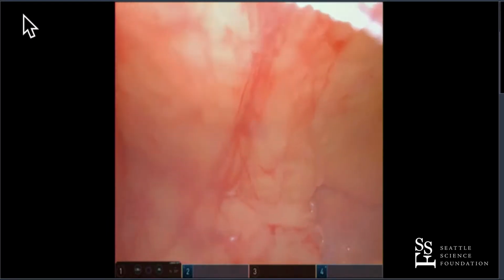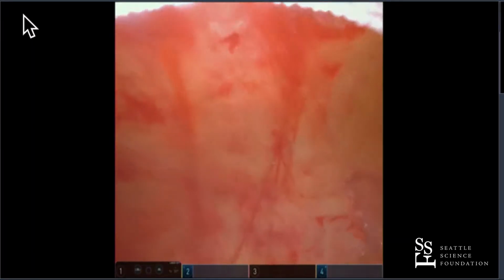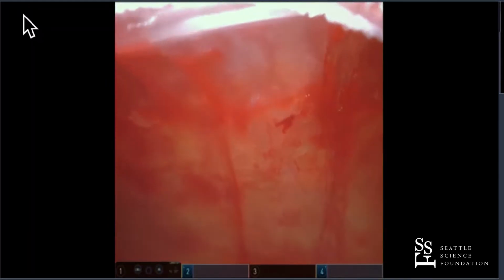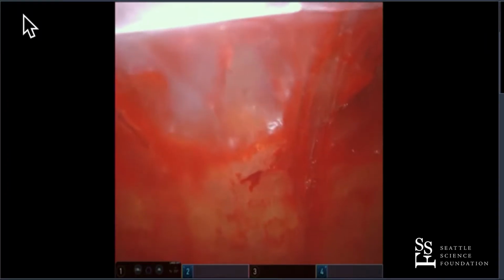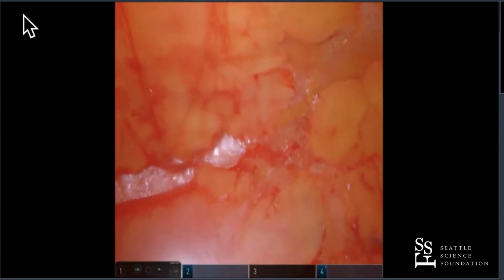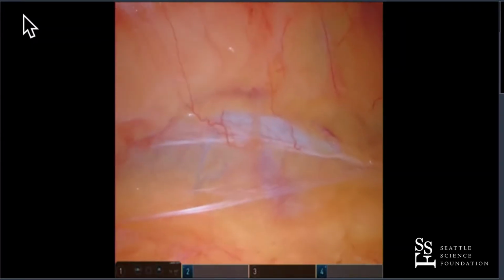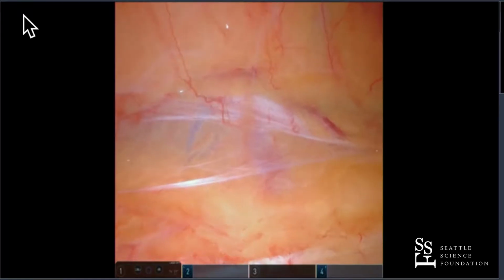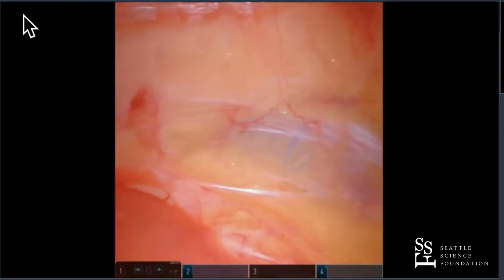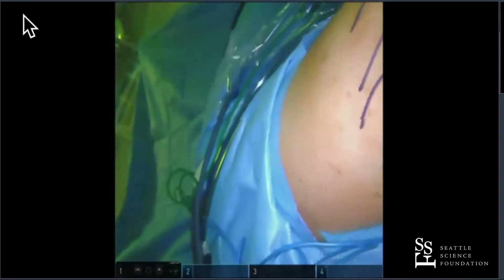Keep going, doctor. Yeah, it's not very distinct, but it's right about there. Keep going, doctor, right there. That's good. Let's go with that. All right. So that's our space. We've got gonadal right there, ureter, you can see kind of moving right there. And we're actually pushing it to the aorta. You can see the aortic pulsation there. Cava is going to be right here. Cava's flattened out. So we're going to come out with the balloon now. All right. Go to the external view. Let's go to external view.